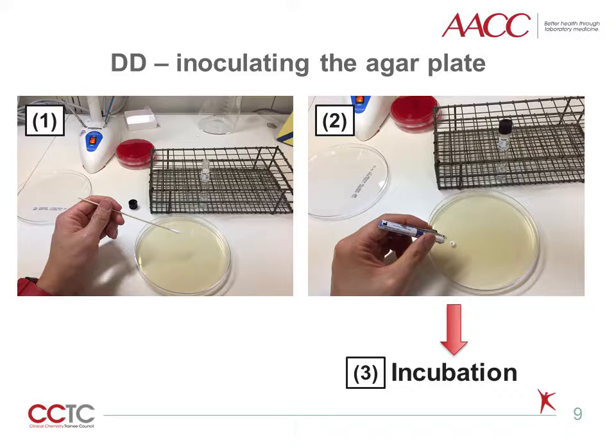Four sets of dispensers can be used. Once all the discs have been placed, the plate is incubated under the appropriate growth conditions. As with the broth microdilution method, some difficult-to-grow bacteria can require additional supplementation. The inoculated plate is incubated at 35 degrees in ambient air for most organisms for up to about 16 to 18 hours, but some may require longer incubation and/or carbon dioxide.